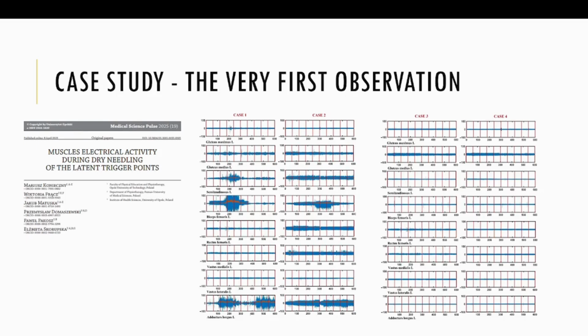We observed that in most participants, when referred pain appeared, a specific and selective bioelectrical response also occurred. Initially, we hypothesized that we could detect changes in the superficial EMG signal by comparing bioelectrical activity during a maximum voluntary contraction with the signal recorded during the SP test. However, normalization failed, and we had to take a different approach.